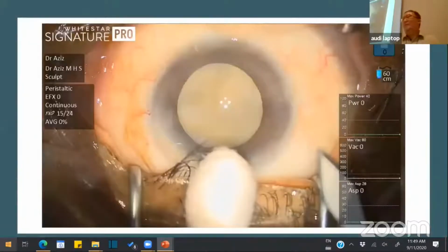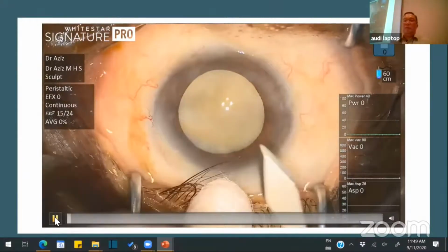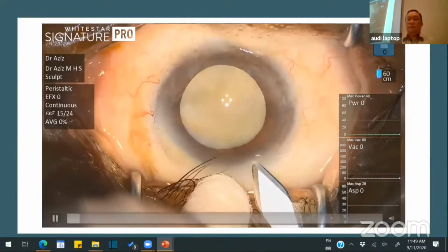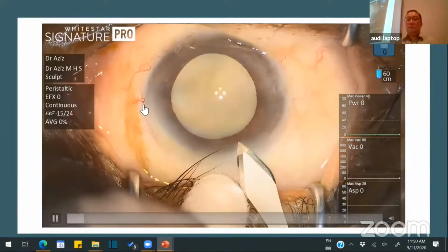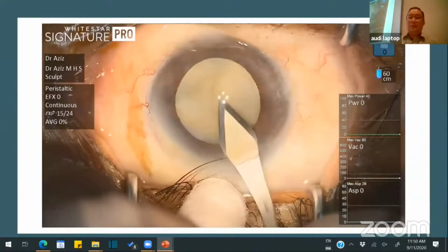All right. This one you need vision blue, okay, for sure. Dense cataract, intumescent cataract. Okay? So it's the same thing, it's routine. So you hold with your cotton bud. Two steps wound. If you want to do 3 steps also, okay.